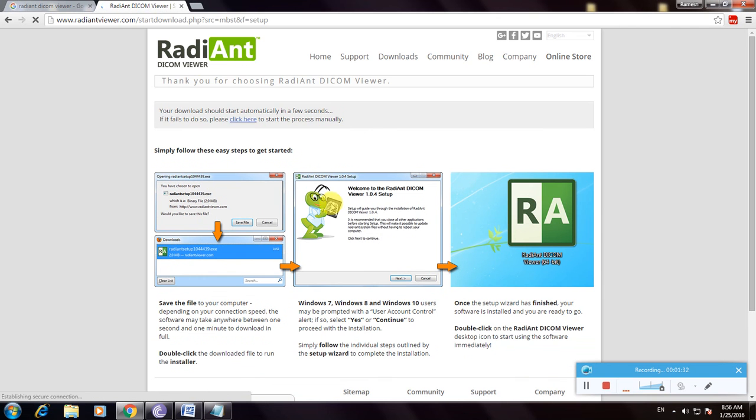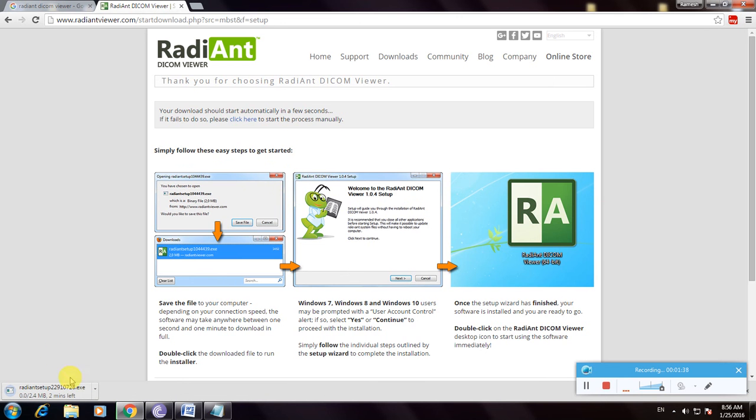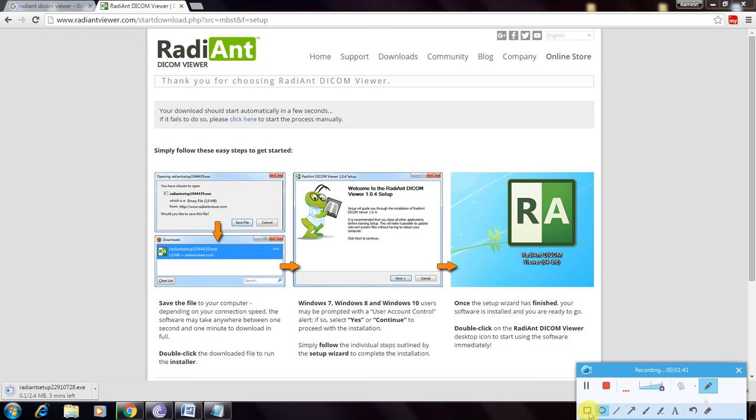The file is loading. These are the instructions with simple steps to get started. The file is downloaded here. If you want to see it, I will show you.